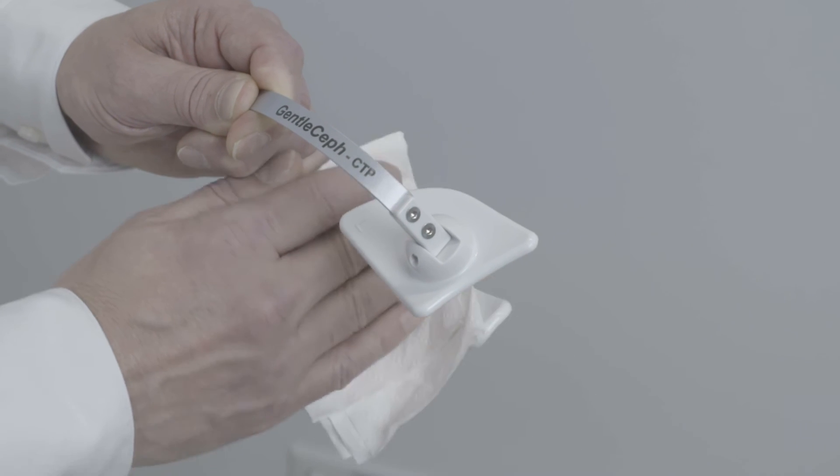The instructions for use can be found on the instruction card. We wish you success with the use of your thyroid protector. We are happy that your patients will receive a much lower radiation dose from now on.